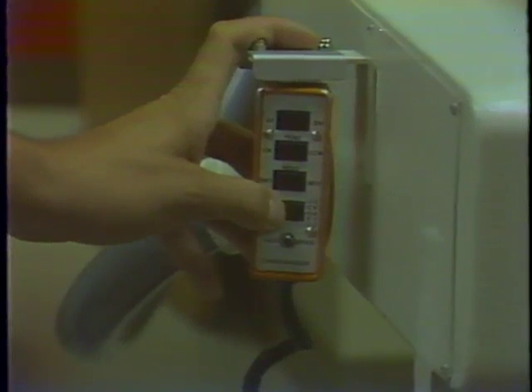The technologist waits until he first sees the radioactive material he put in the blood reach the head, and then he pushes the button to start the machine. These are the 16 images of the blood flow to the head that I mentioned earlier. Each of these is taken about 1.5 seconds apart. It shows the radioactive material going into the vessels of the head and then coming out through the venous structures.